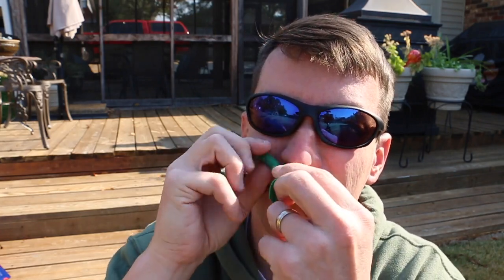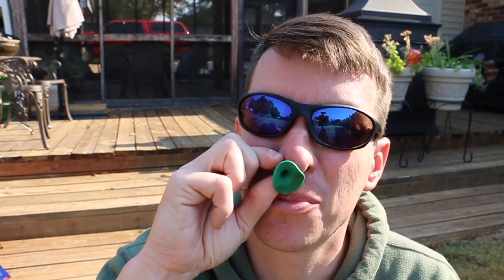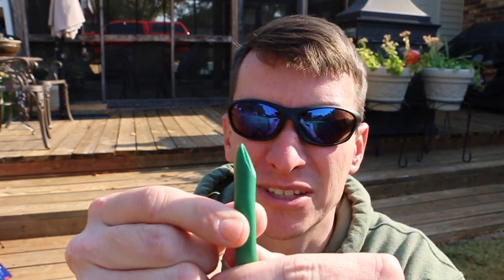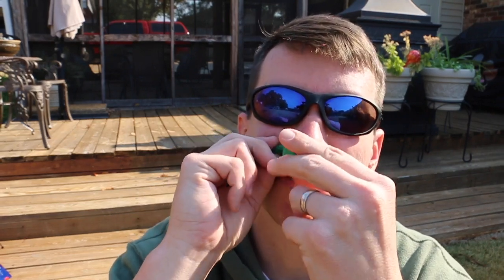This inserts into the nose, and you push this all the way in until it buries into the nose. This is the only part here that's going to be sticking out. Typically you use the right nare, but insert this bevel, hopefully that picks up on camera, bevel towards the middle of the nose, insert, and push it all the way in. This is going to protect someone's airway.